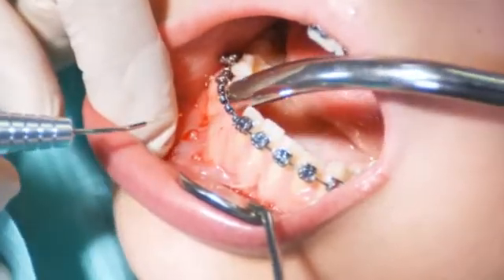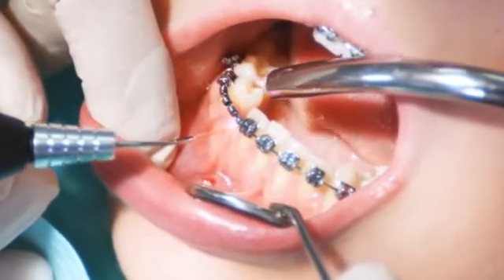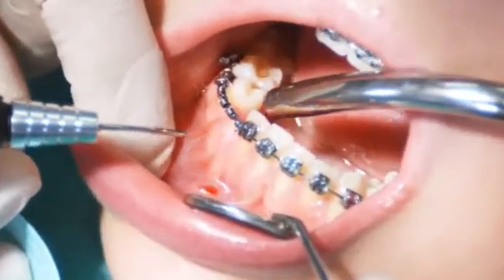Tighten the tissue and use the laser tip like a scalpel to remove the tissue. Work in contact with the soft tissue, performing stroking movements with light pressure.